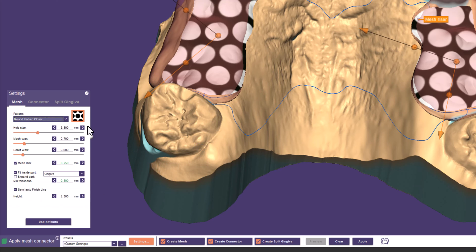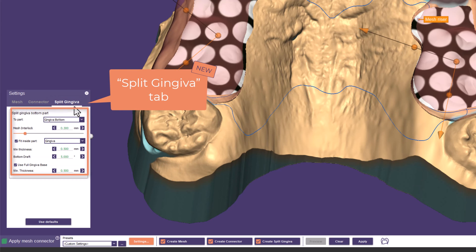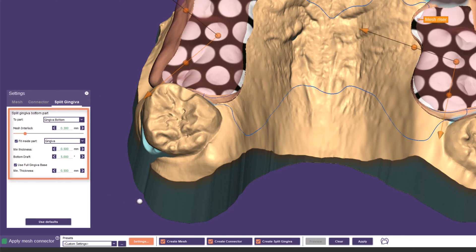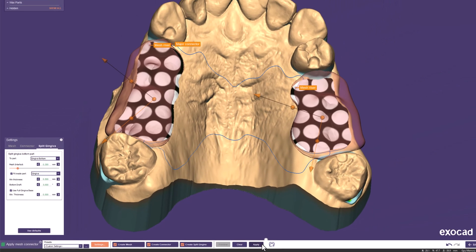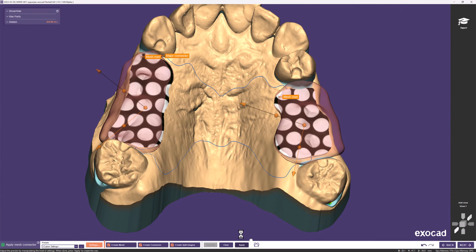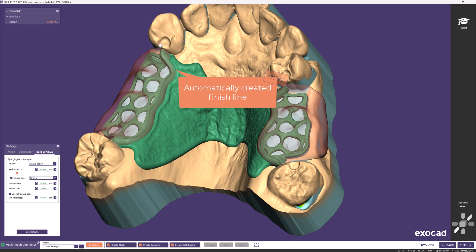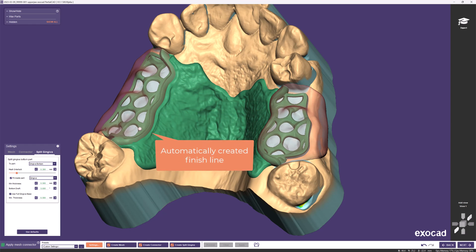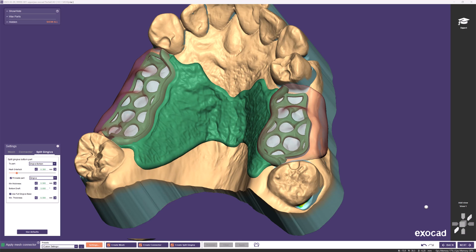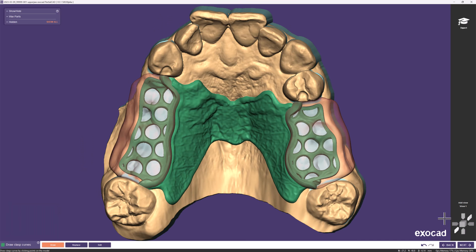We added a new tab called Split Gingiva, which contains all parameters needed for the Quick Snap design. For now we use the default settings and click Apply to start the calculation. Three different buttons at the bottom are activated: Mesh, Connector, and Split Gingiva — allowing you to calculate only the parts you are currently working on. You can see how the automatically created finish line exactly follows the previously designed gingiva, which is why it's important to shape the palatal area accordingly in DentalCAD.